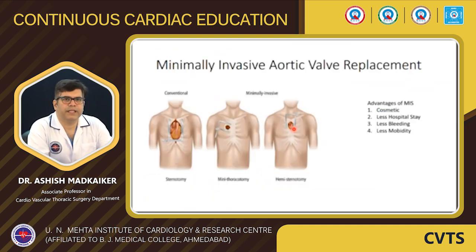Now that we have seen aortic valve replacement in a conventional way, with certain modifications depending on what type of valve we are using or newer techniques that are available, we will apply this principle in a minimally invasive approach. The advantages of minimally invasive surgery, as we all know, are that it is more cosmetic, with less bleeding, less morbidity, less hospital stay, and many more to count.